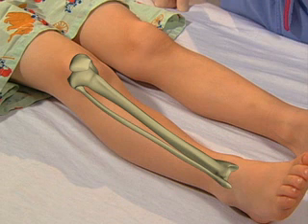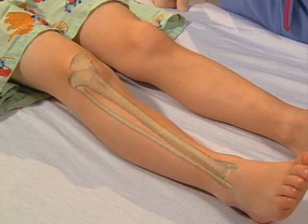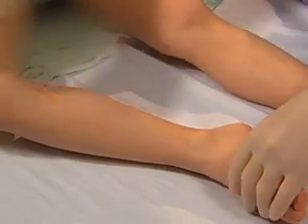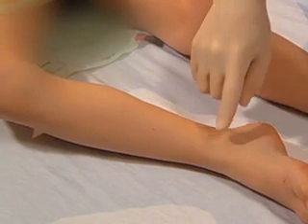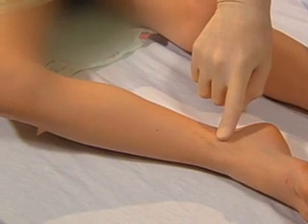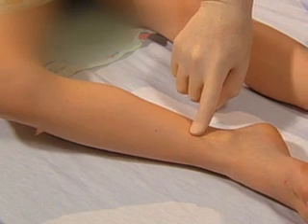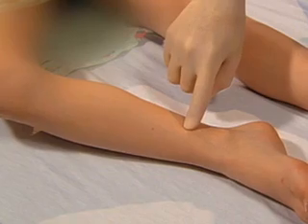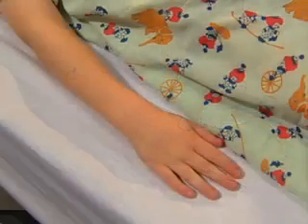It has less cortical thickening than the proximal tibia, so it is preferred in older children. Place the hip in a frog leg position to expose the distal tibia. Identify the medial malleolus. The intraosseous insertion site spans the flat portion of the tibia, 1 to 2 centimeters proximal to the superior margin of the malleolus.